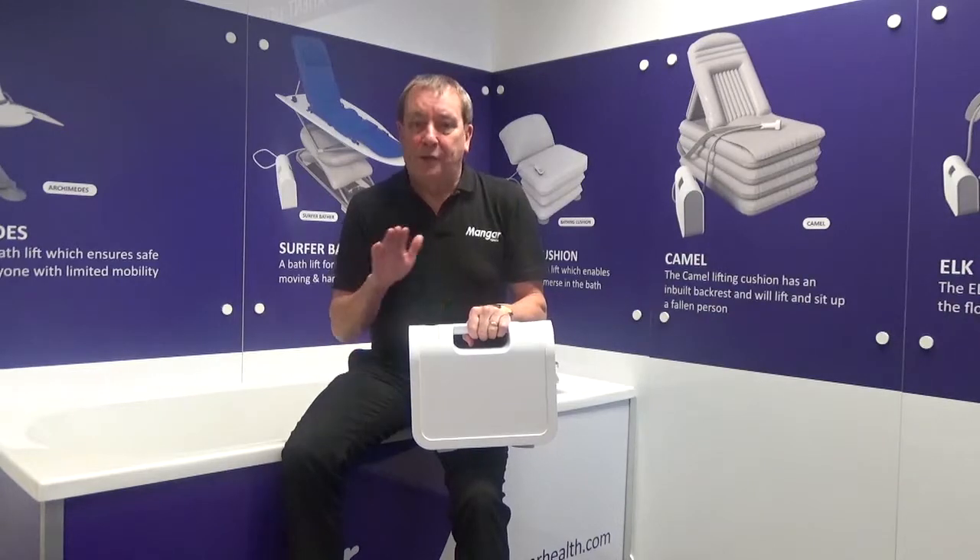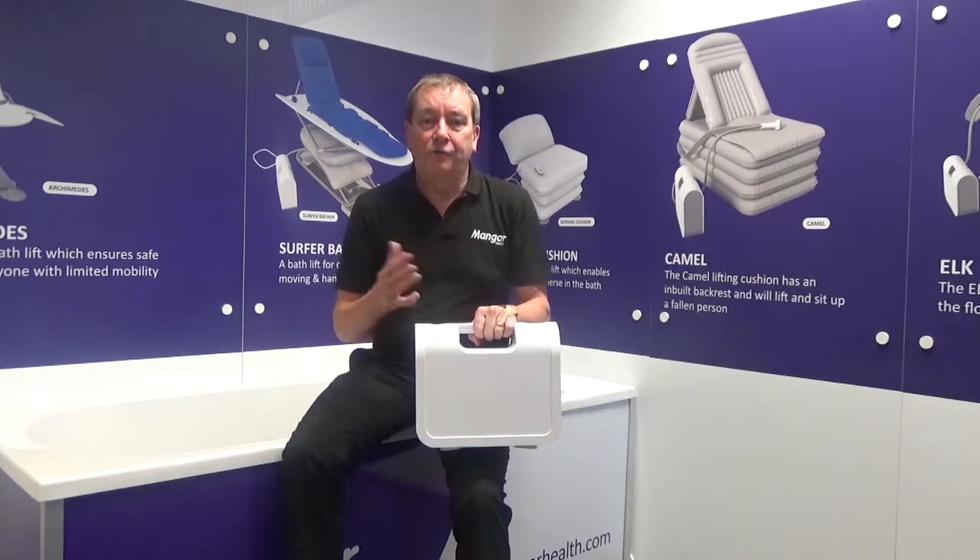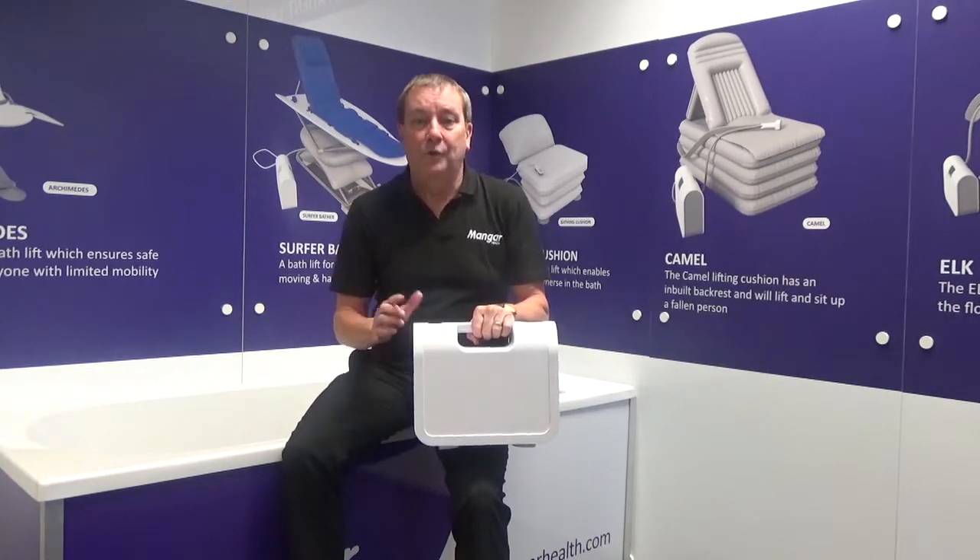Once we are happy that our battery is completely charged, it's ready to connect the compressor to our Manga product.